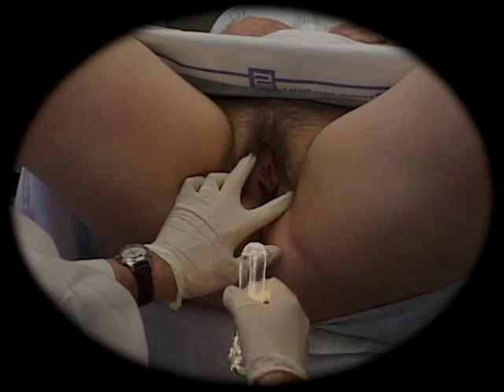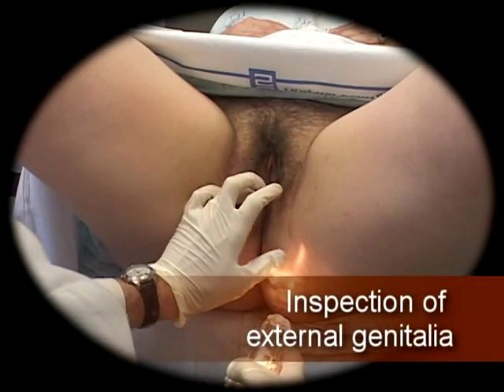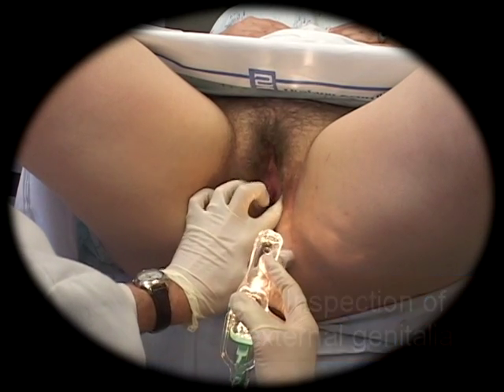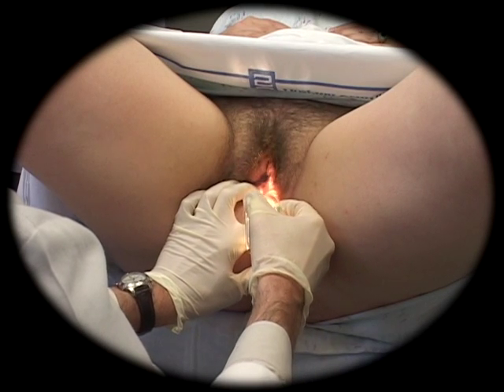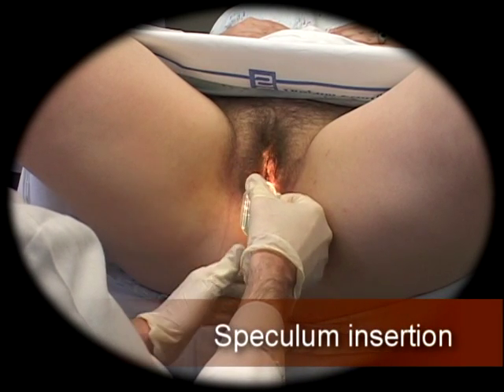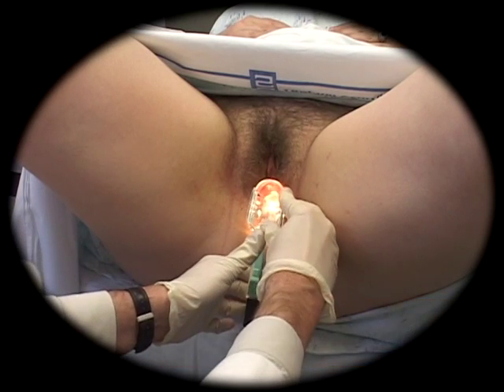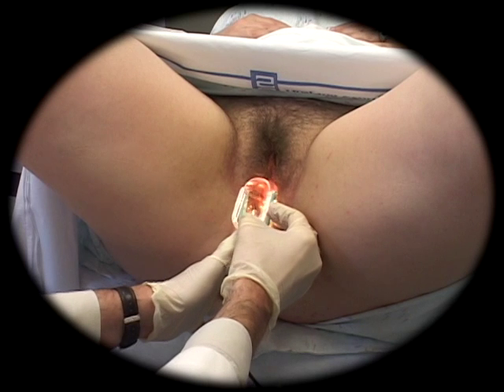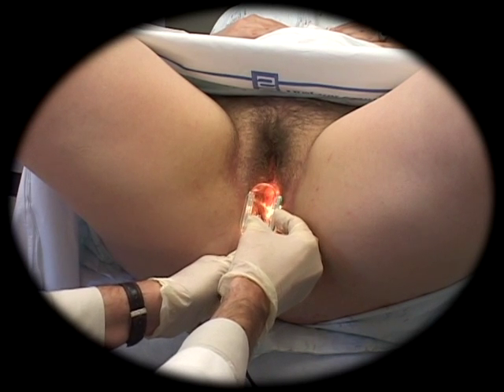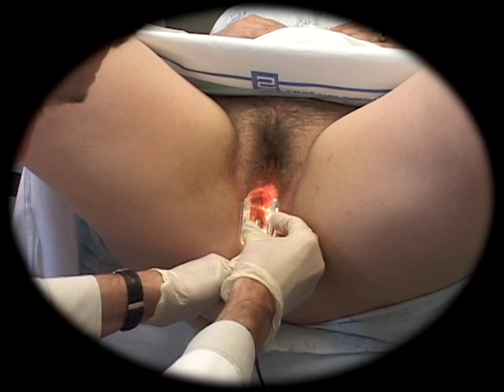Inspect the external genitalia for lesions, then carefully insert the speculum. Guiding the patient to relax the perineal musculature can make insertion much less uncomfortable. Clearly visualize the cervix.